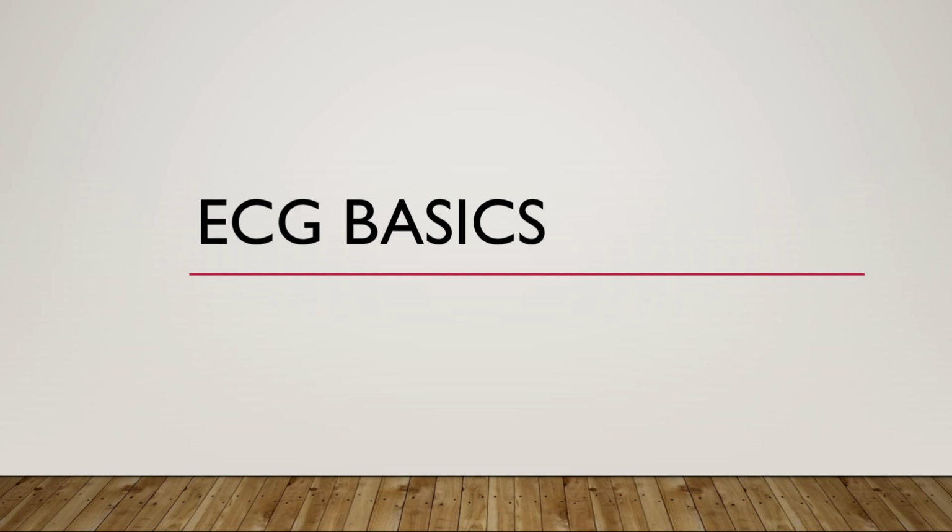In today's video we are going to discuss the basic steps in interpretation of an ECG.